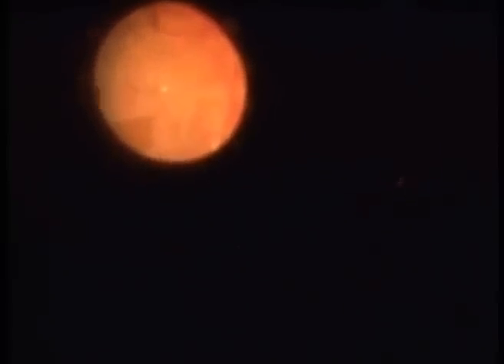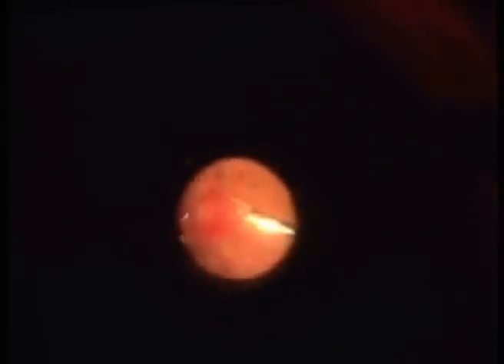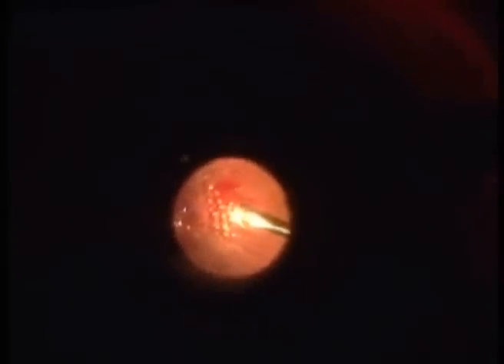Note the egress of sub-retinal fluid through the open retinal tear when all residual traction is relieved. The traction nasal to the disc is also relieved. Perfluorocarbon liquid injection is performed to mechanically flatten the retina. It is absolutely essential to ensure adequate retinopexy around the tear in addition to performing pan-retinal photocoagulation. The perfluorocarbon liquid in the vitreous cavity is exchanged for silicone oil, thereby achieving a stable attached retina.